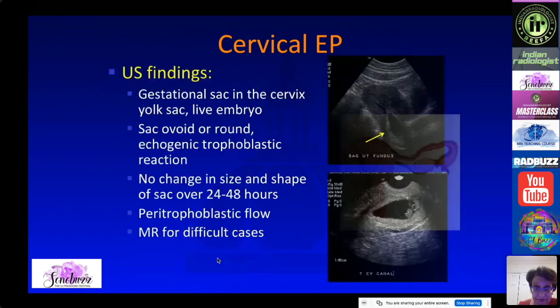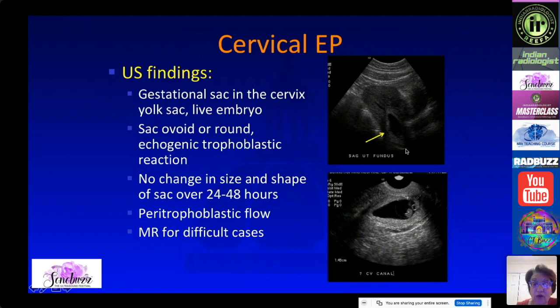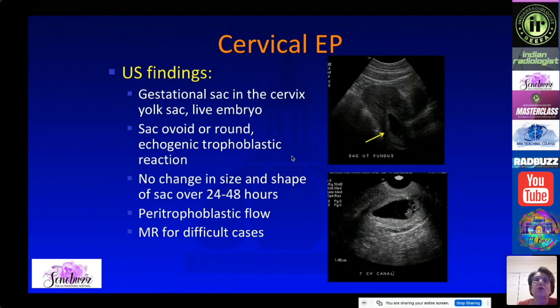On ultrasound you will see a gestational sac within the cervix. If there is a live embryo with a yolk sac, as in this case, the diagnosis is relatively straightforward. You can see the hourglass deformity of the cervix. If you are unsure whether it is a cervical ectopic or an abortion in progress, follow-up in 24 to 48 hours is helpful — with abortion there is usually change, whereas a cervical ectopic pregnancy will not move.